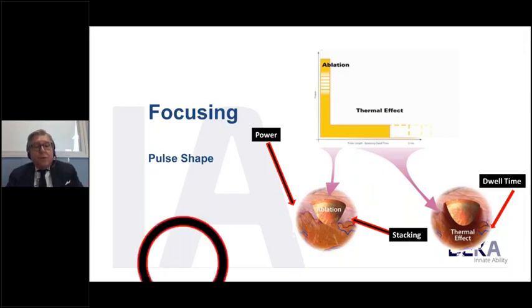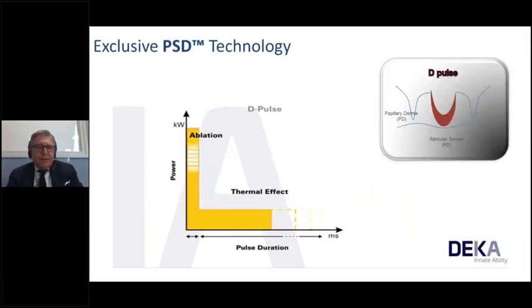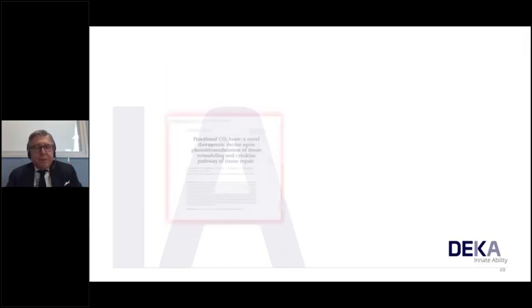But there is a 4th parameter, the pulse shape, and in particular DP, that we use in 90% of cases of fractional treatment, that allows us to go into the depth, stimulate into the depth and microablate in the deeper layer. You see the pulse shape design and the pulse modes, the great capability to go into the depth and the ablation crater, very, very deep.